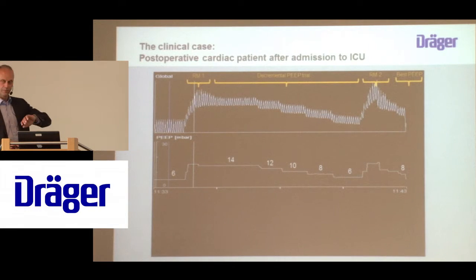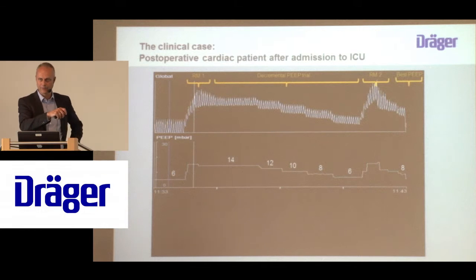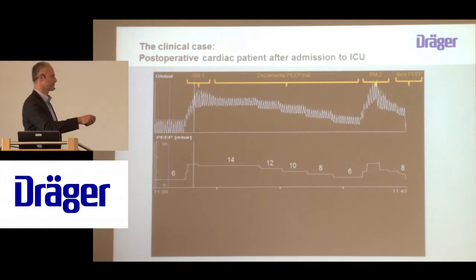And before we go for another break, let me demonstrate one clinical case. That is a patient from a clinical study that was performed, 1 out of 40 patients, after cardiac surgery, all with healthy lungs, so I would say they all had extrapulmonary conditions.